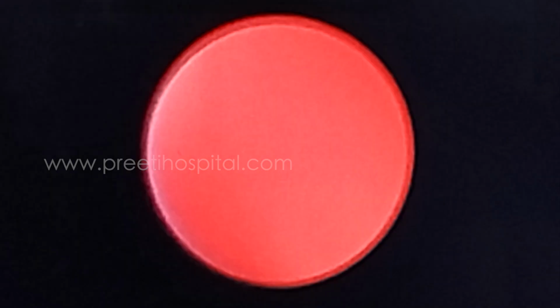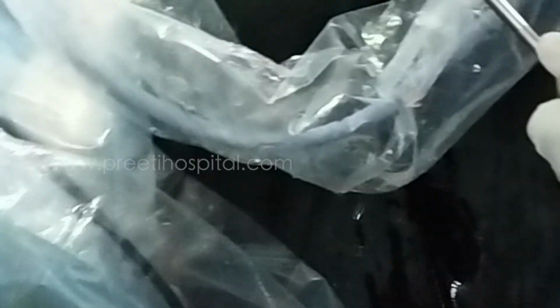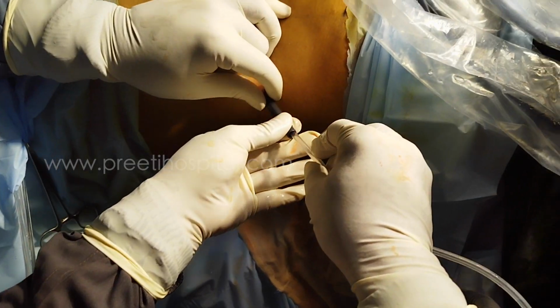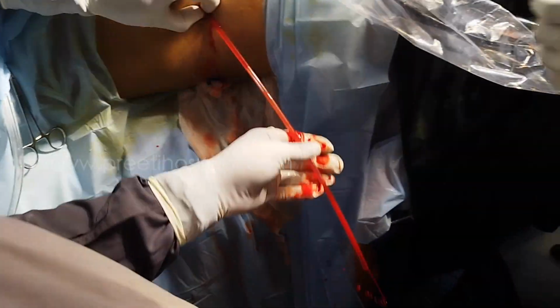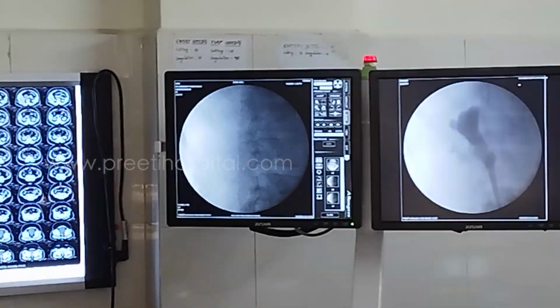Okay? Do you require nephrostomy? Nephrostomy, if you want to put it, you can put it. Now I will put it. Okay? I will come out completely. And now what I will do? I will inject the contrast. What will it tell? C-arm? It will tell the tract.